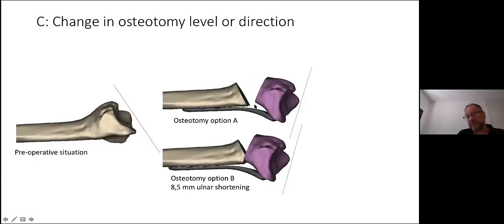That will be a little bit problematic for the healing, but it will also be problems when you distract something this far. Usually the muscles and the ligaments and so on, when this has healed in this position, they shorten, so it's very hard to get it out in the right positions. It's high tension here, and you don't have the bone cavity.